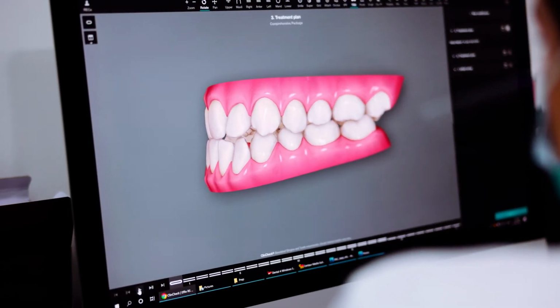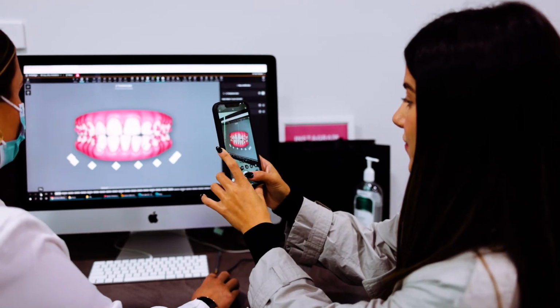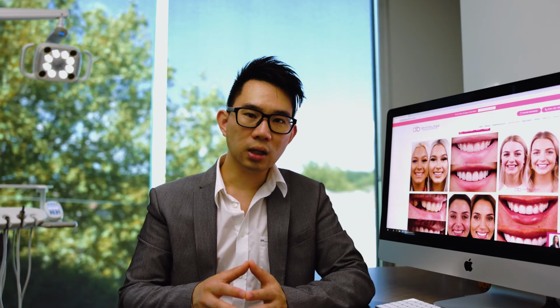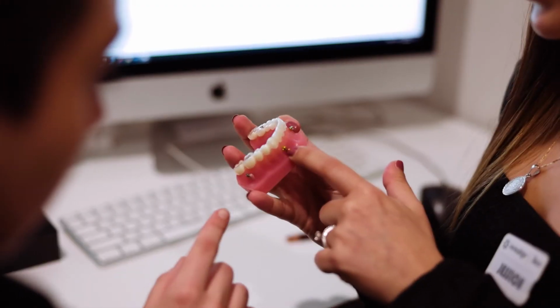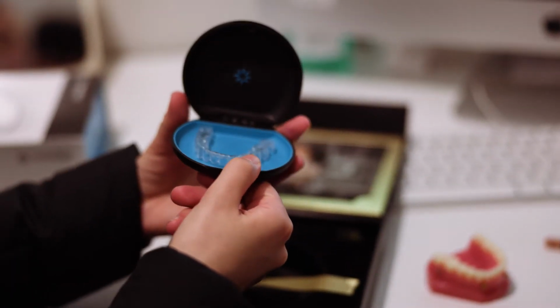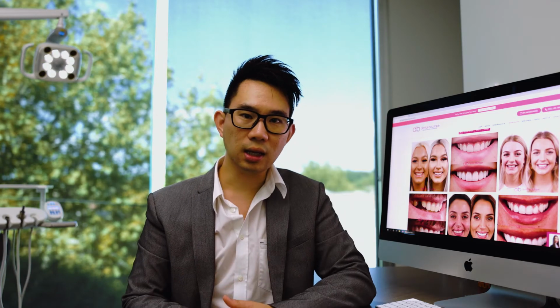So the disadvantage with Invisalign is that you will need to be compliant with the treatment, because if you do not put Invisalign in your mouth, it will not work, right? Typically it should be worn at least about 20 to 22 hours a day. That is really important, because the more contact time the aligners have in your mouth, the quicker your teeth move. For sure, you can wear them for fewer hours in a day, but that would mean you'll prolong your Invisalign treatment time. So there's always a give and take with clear aligners.